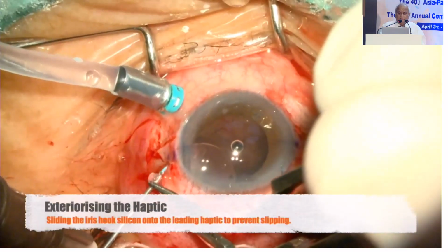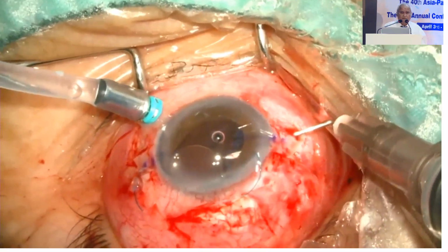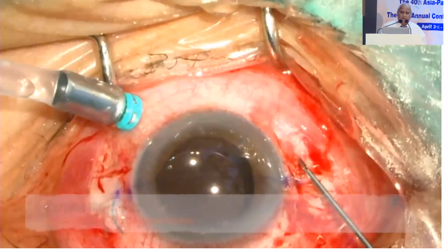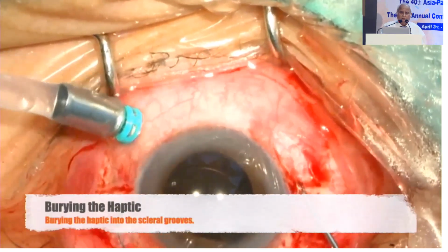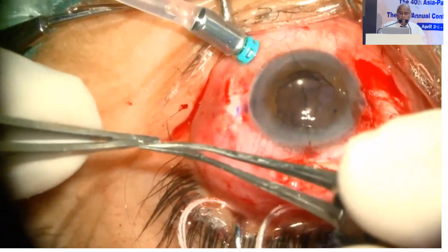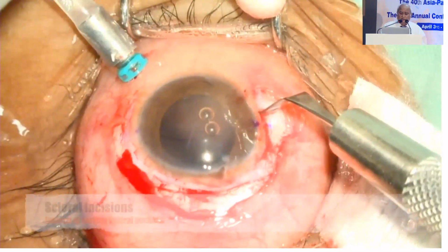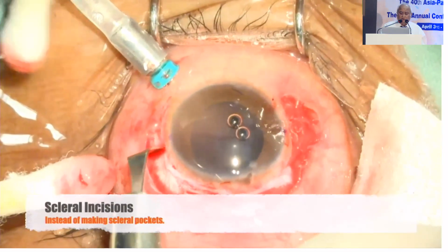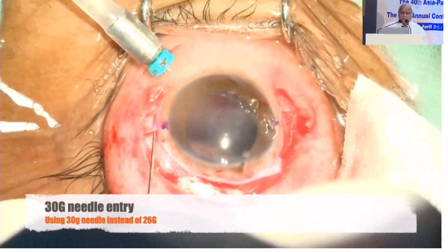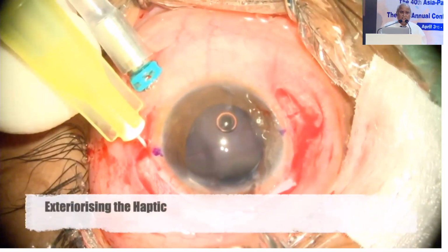It takes longer than the iris fixated IOL, whereas if you implant an iris fixated IOL, it's almost the same time that you take in implanting a foldable IOL, apart from the vitrectomy that you do. So these are some of the cases wherein you can implant these and suture them. There are some other modifications also in this, done by one of his friends there at Chitrakoot. So these are some of the cases that can be done with scleral fixated. Results are very good with all kinds of techniques.